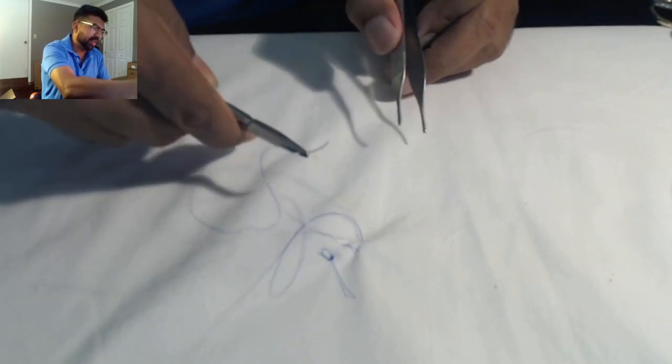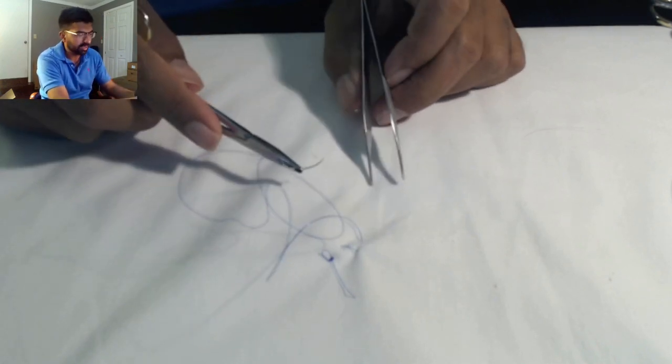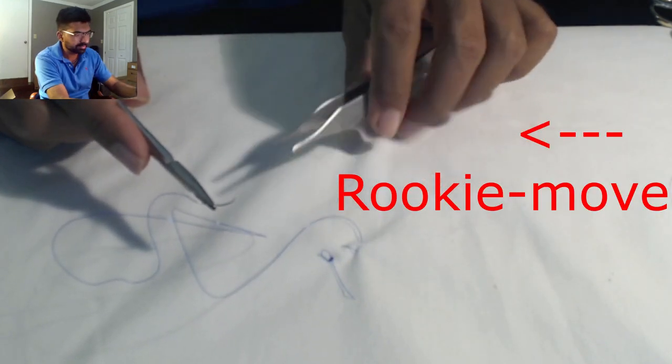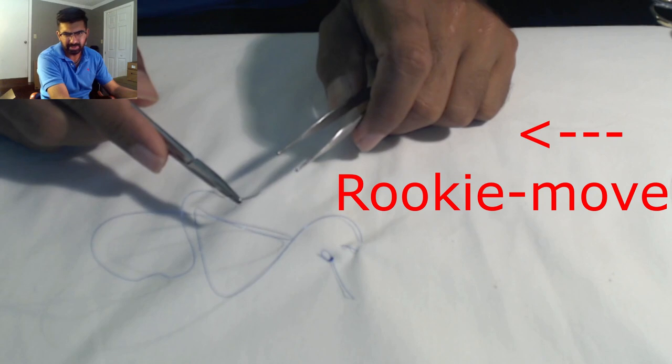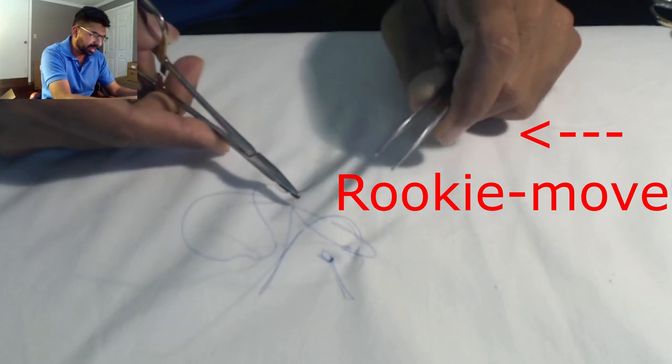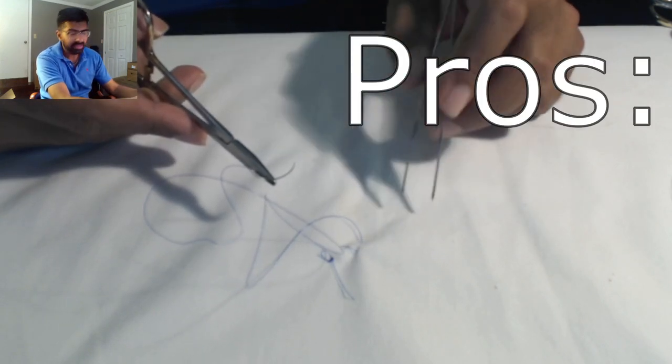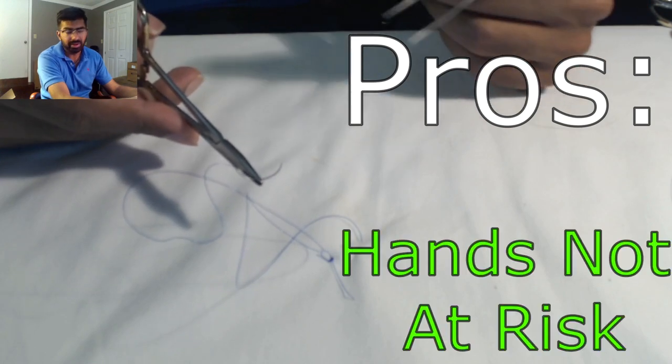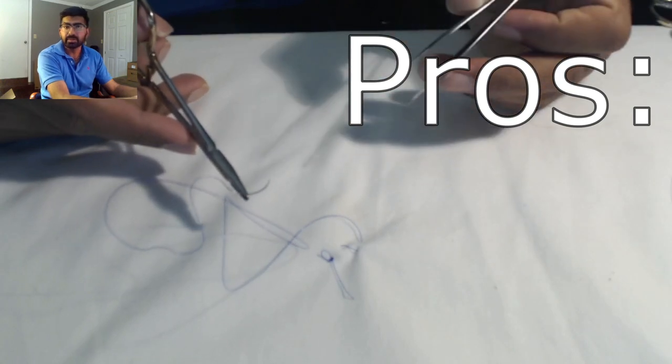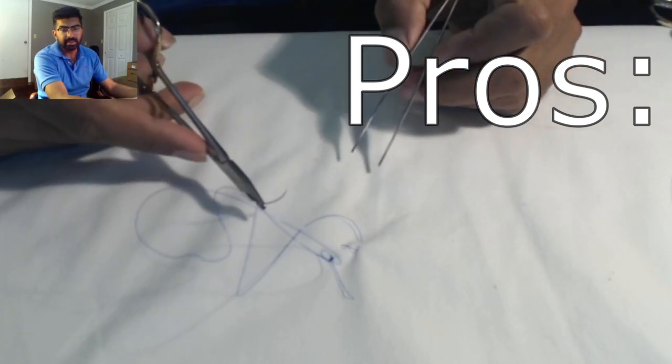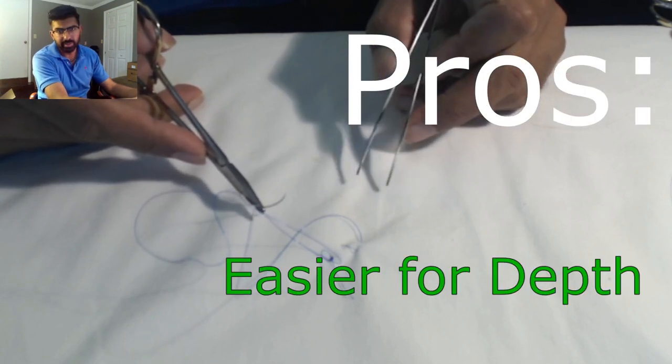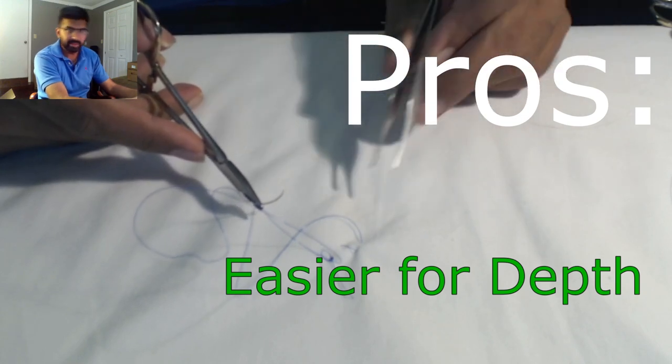This is something I see more often interns do. When they're setting the needle, they'll take their left hand and hold it on top so it doesn't move, then they'll set it and reload it. The benefit of this technique is number one, unlike hand reloading, you are not necessarily putting your hands at risk. Number two, in certain deep situations where you're down in the belly, you can't necessarily reload the needle with other techniques and you don't want to reach in there to grab it.